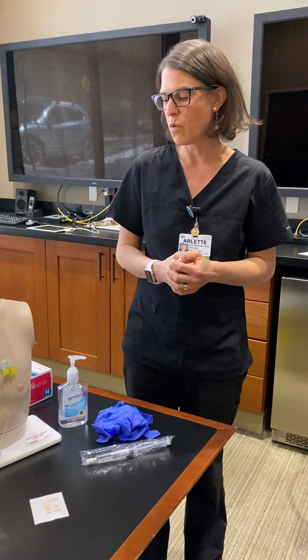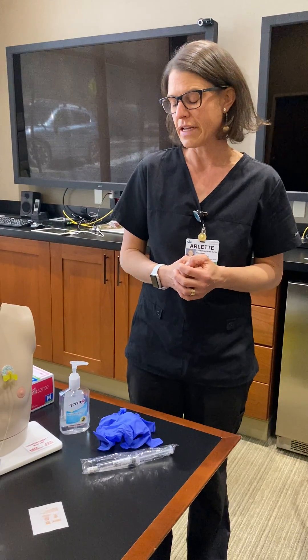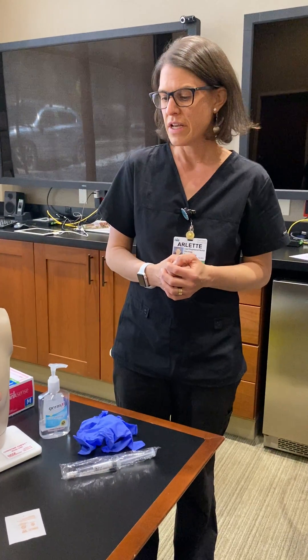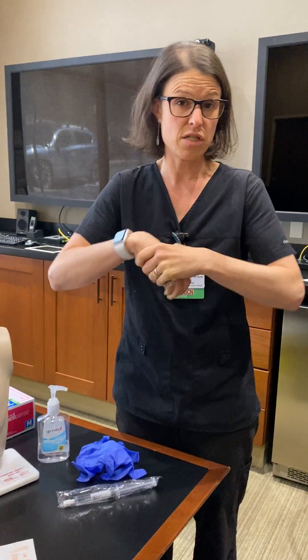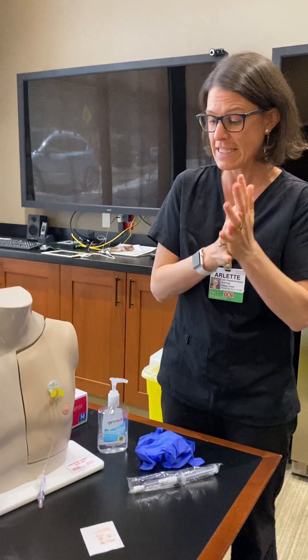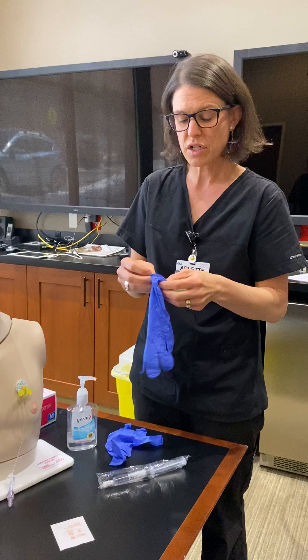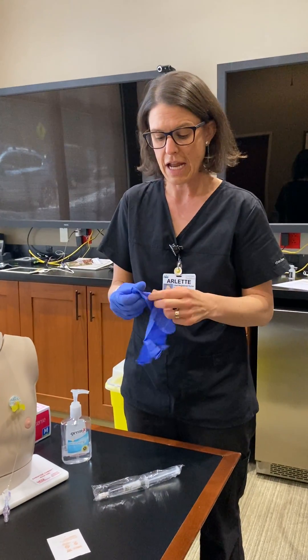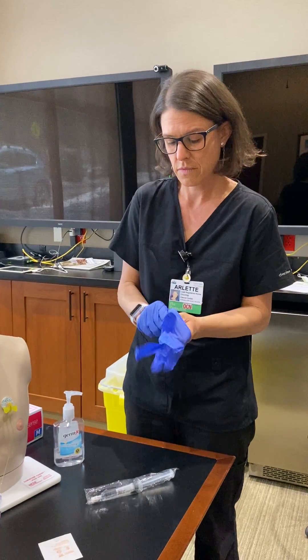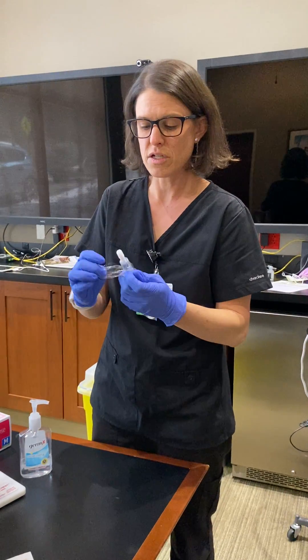In this portion of the video we are going to talk about deaccessing a central line, specifically a port. The first thing you'll want to do is wash your hands. We took the tegaderm off the patient already since he has a tendency to stick to our fake skin here. This is considered a clean procedure, not a sterile procedure, so you'll get regular gloves and you'll want to get a 10cc syringe.